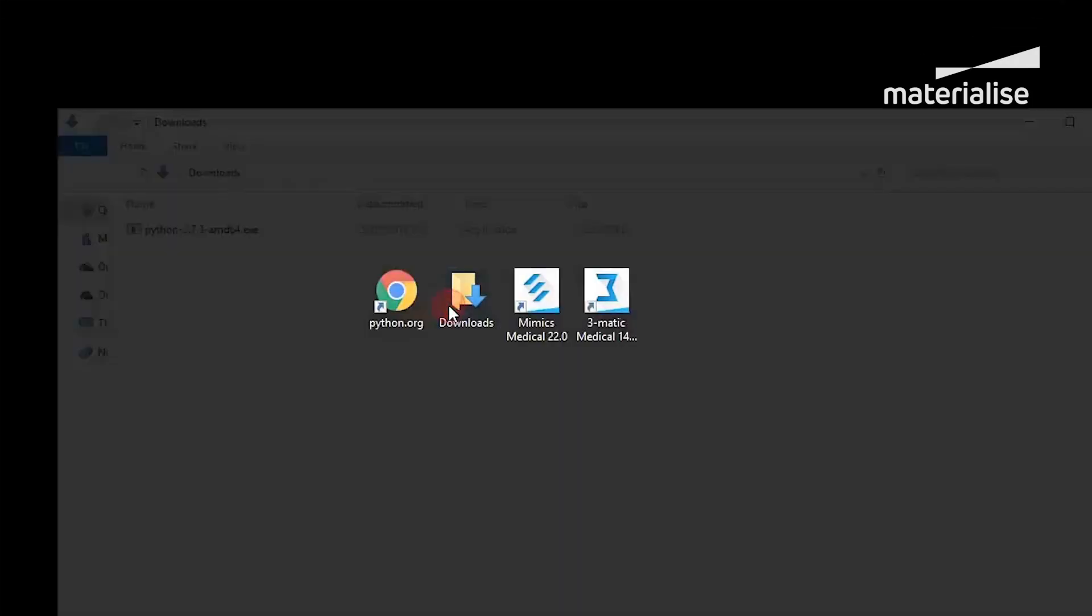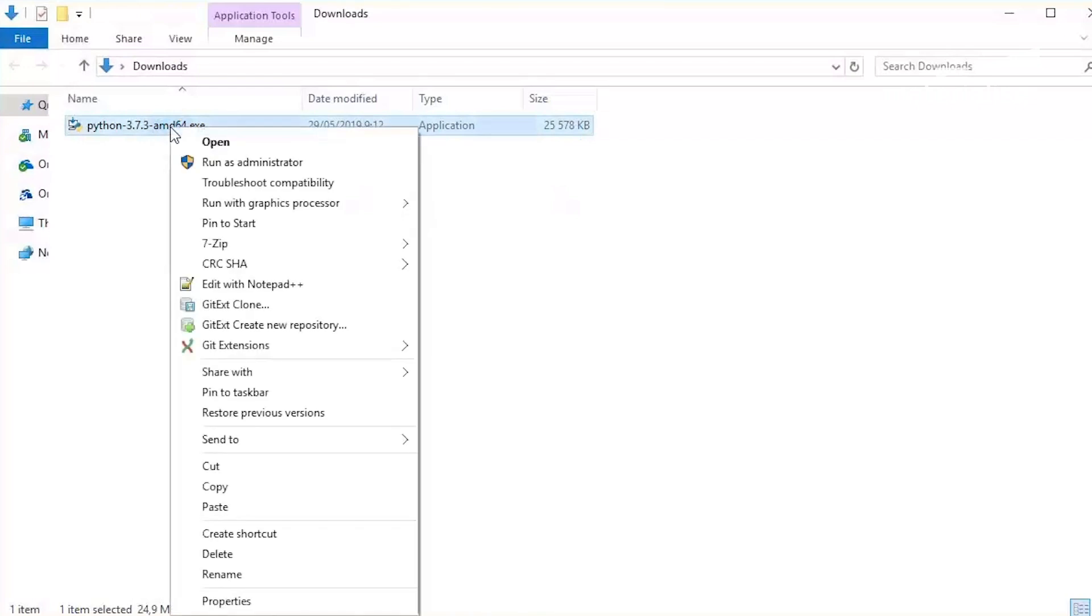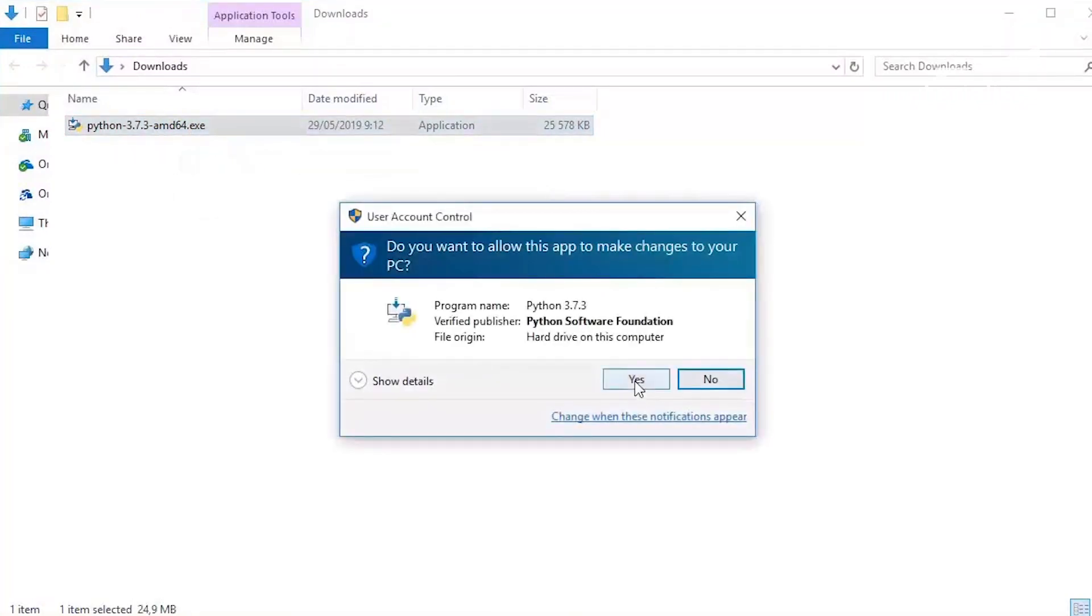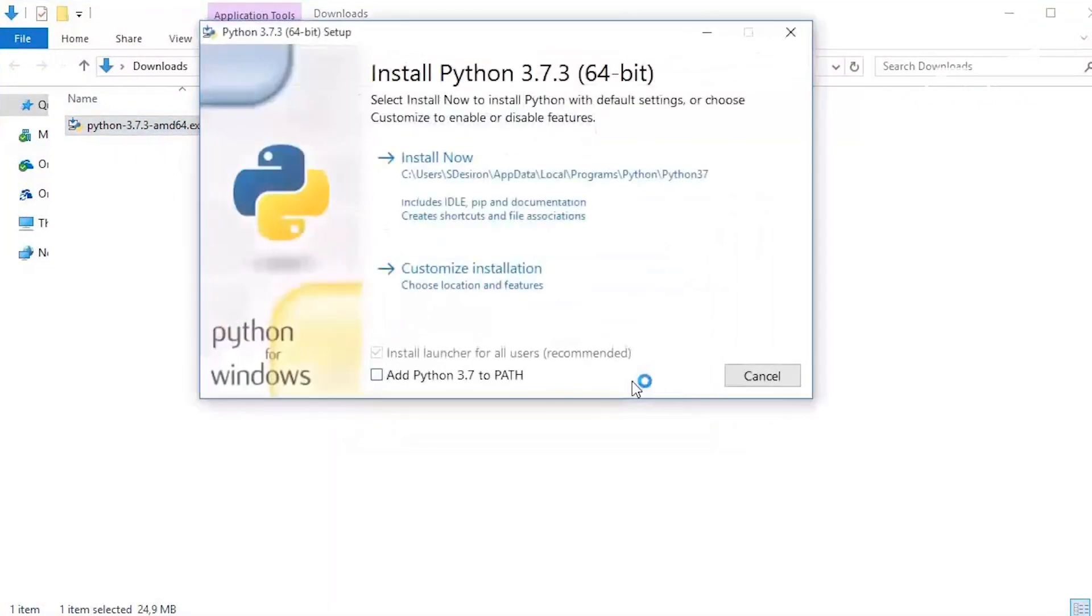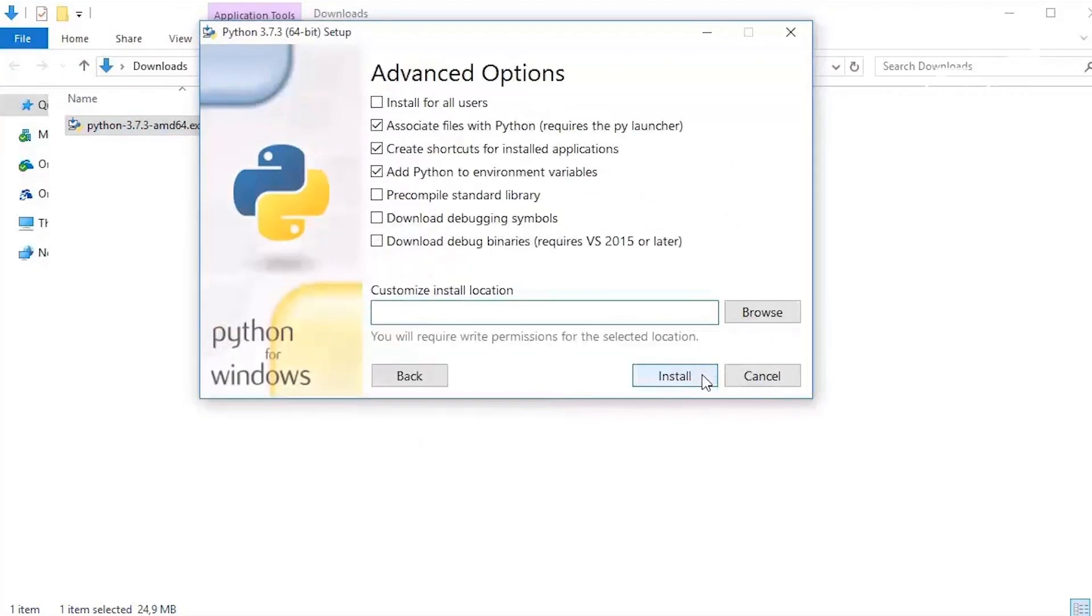Once the download is complete, run the executable as an administrator and the installation wizard will appear. We advise to choose the Custom Install option, which allows you to set the installation path.